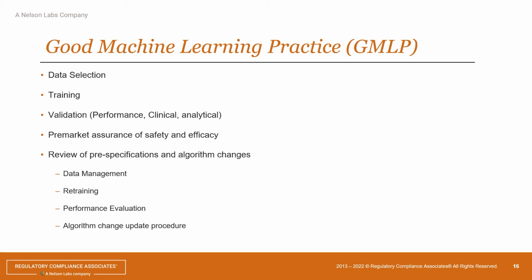Obviously, locked algorithms are the way that most people go. At this stage, I don't think we have enough algorithms that learn on the fly, because that requires a lot more controls in terms of monitoring the actual stuff that is going on out in the field. But there are a lot more locked algorithms that FDA has already cleared.